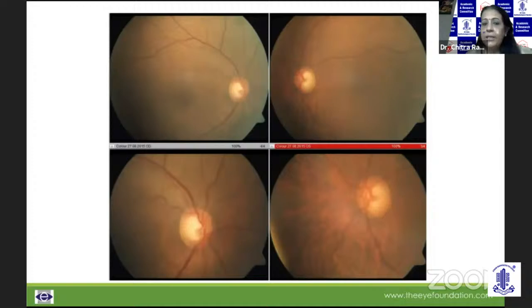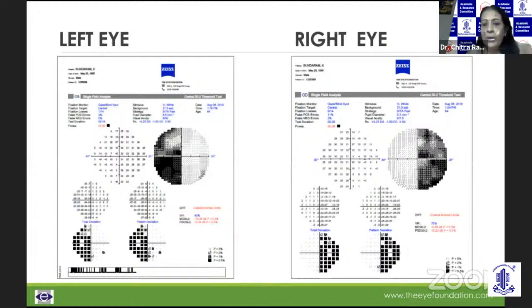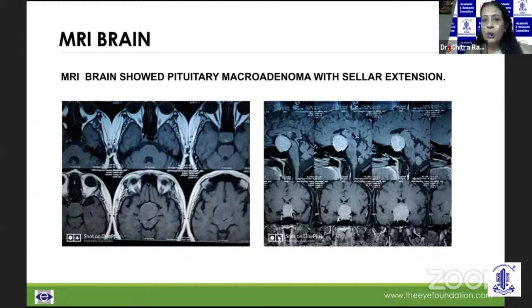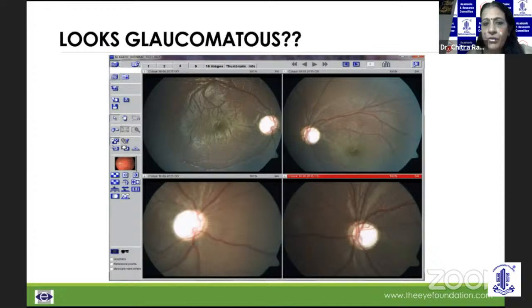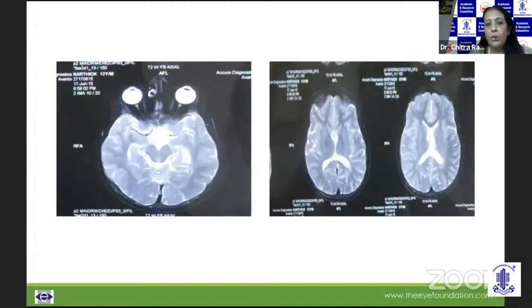Here is a case that looks glaucomatous — a vertical oval cup with not very obvious rim narrowing — but the visual field showed a bitemporal hemianopia. The field and MRI revealed a pituitary macroadenoma with sellar extension. Another disc was being treated for glaucoma but showed IOP-unrelated factors; a history of perinatal hypoxia was elicited, and MRI showed hypoplasia of the corpus callosum and periventricular leukomalacia, indicating we were looking at an optic disc excavation.